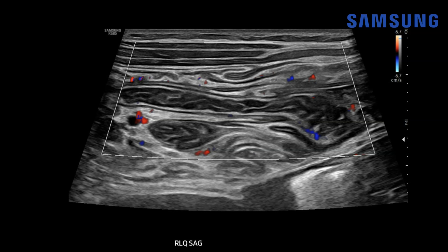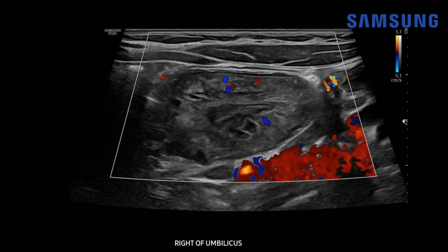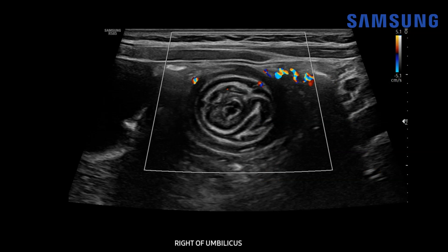We're starting with a view of the right lower quadrant here. This is the cecal apex and here's the appendix extending off — the appendix looks normal but we don't really see the appendiceal tip. As we continue to evaluate the right lower quadrant we see abnormal thickening at the apex of the cecum. We do see normal blood flow within the cecal wall, and on short axis we see this targetoid appearance of the bowel.